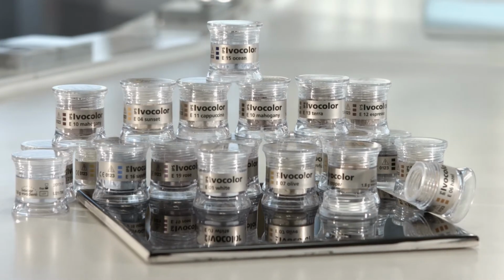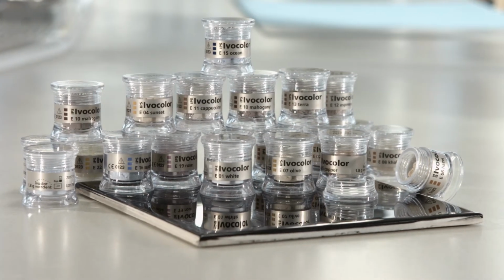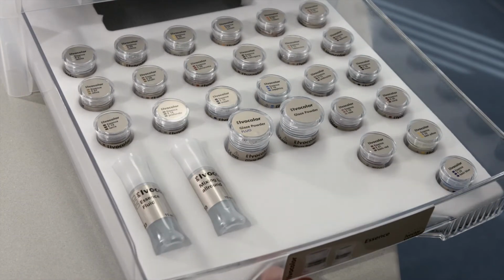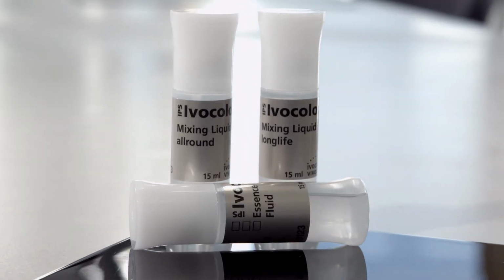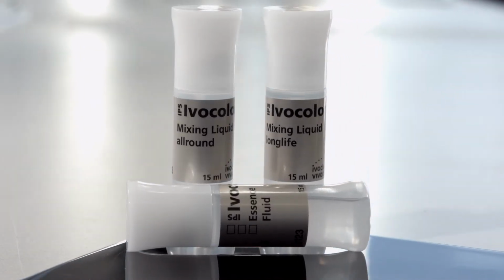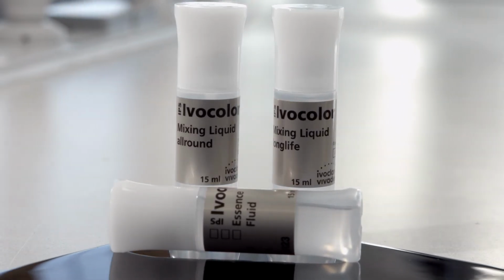IPS Ivocolor essences are stain powders for the individual characterization of dental restorations. They are available in 23 different shades for various characterization techniques. The IPS Ivocolor mixing liquids, all round and long life, and the essence fluid can be used to mix the essence powders.